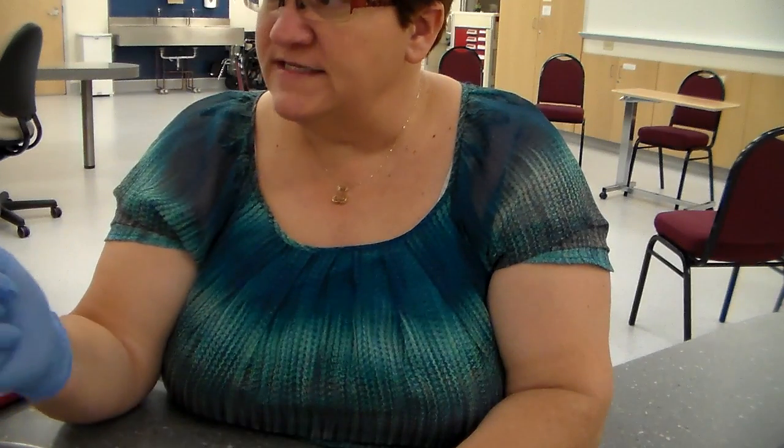You're going to remove your gloves at this point. You're going to make sure that the patient's comfortable and do all your closing down things that you would do for a patient, okay? You're going to remove your gloves if I didn't already say that. You're going to perform hand hygiene, and then you're going to document anything that you just did, especially in the MAR, because you just gave a medication, okay?